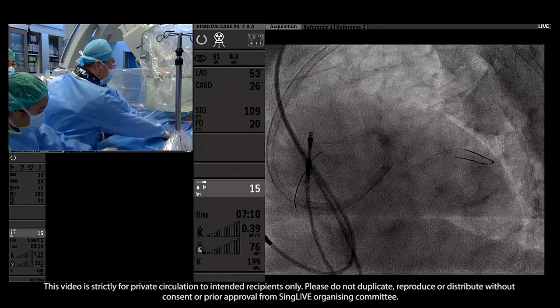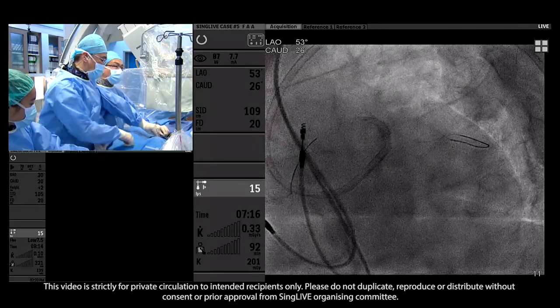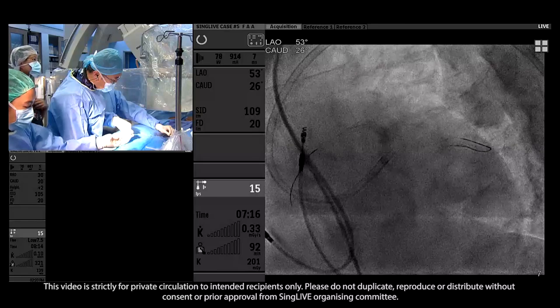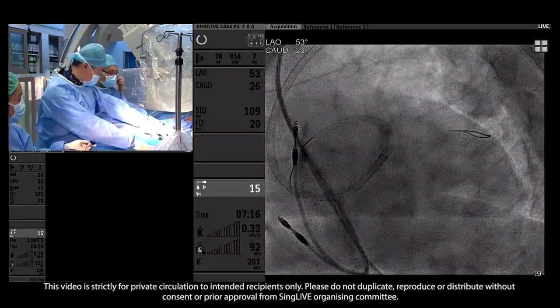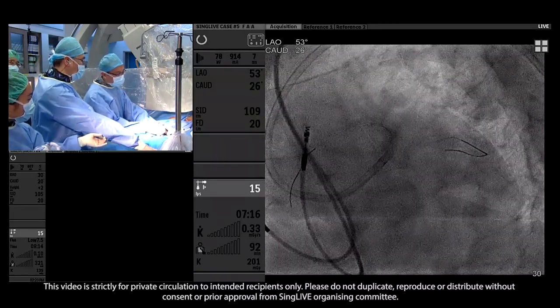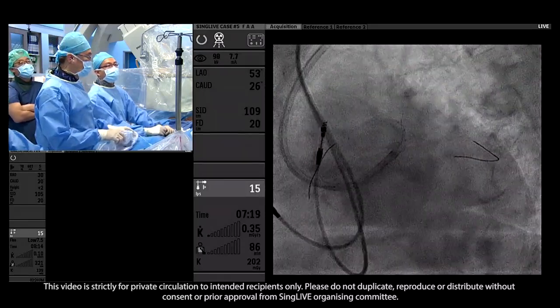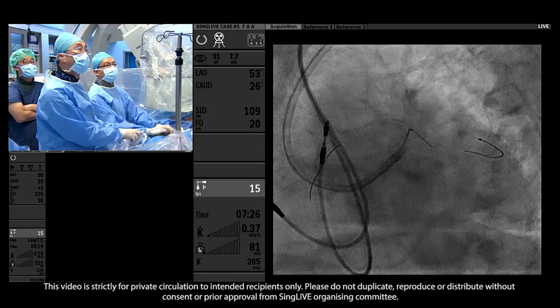I have no experience with the DK crush, but in this case, I do the sequence for the circumflex ostium and the single stent KBD. You do the second one. Based on the angulation and diameter of the vessel, maybe I will choose DK crush for this kind of situation. Actually, I would favor DK crush, given that it's more difficult to widen the circumflex. But with such angulation, I do believe that in the future, in-stent restenosis is quite high. From the other side, jumping, DK crush, right? From China, no need to say.